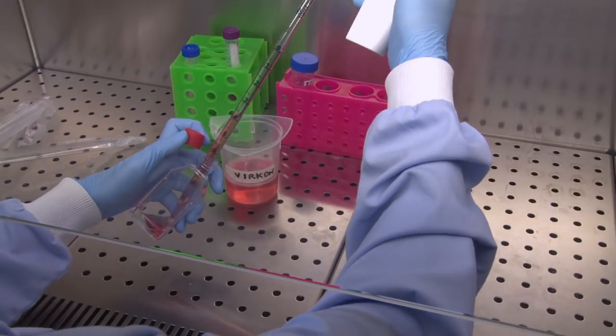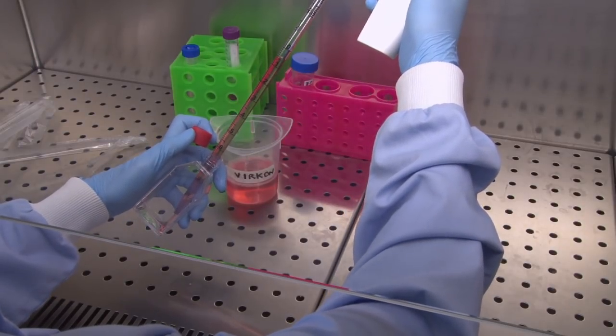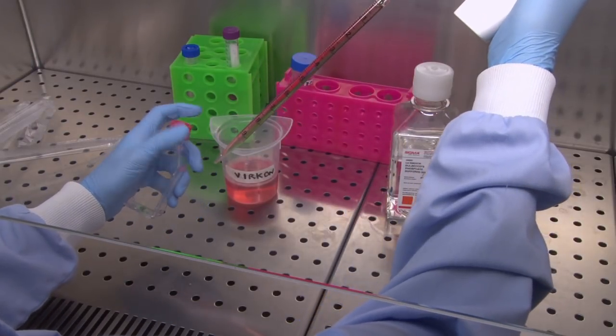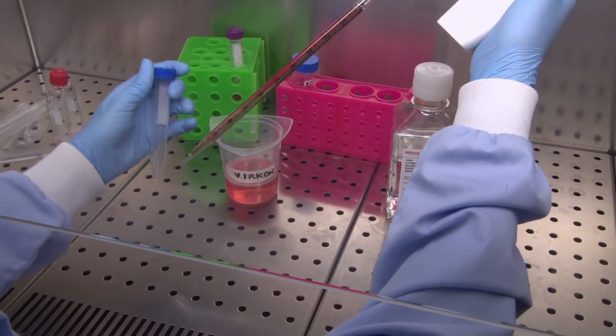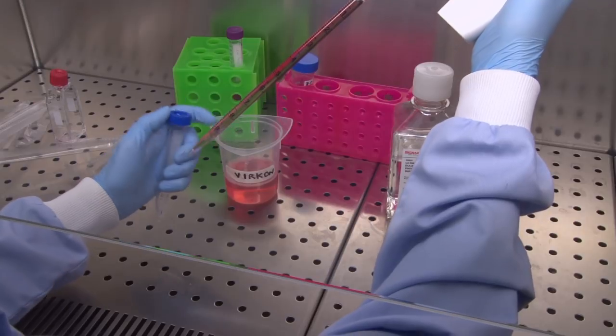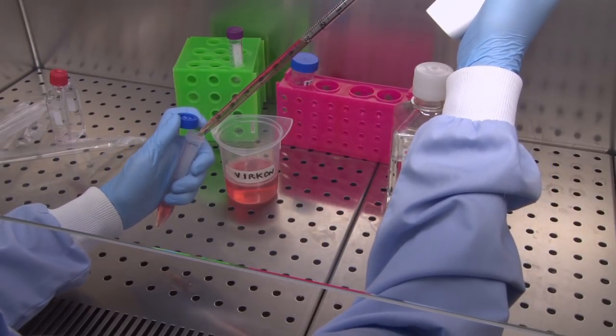Using the same pipette, remove all of the liquid from the flask. And using one hand, remove the cap of a centrifuge tube and put the liquid in before replacing the cap.